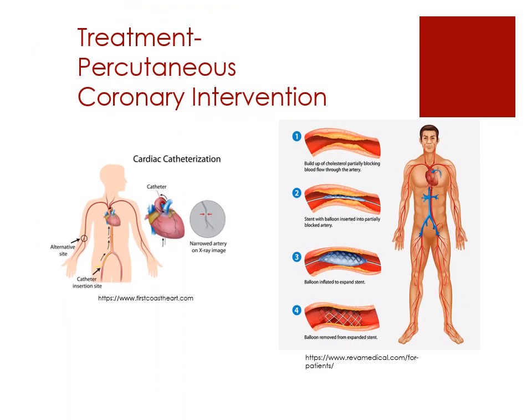Now, what exactly is it that we're doing? Well, we're doing what is now called an angiogram, but it's actually called a percutaneous coronary intervention, so PCI. So as you can see there, we thread the catheter into a femoral line, and it threads up to where that occluded vessel is. We slide that catheter into there.